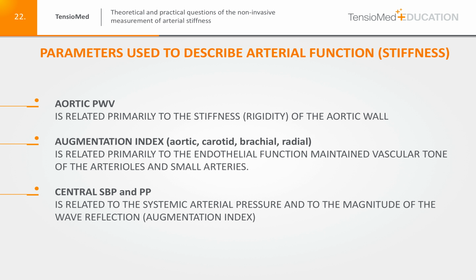And the central systolic blood pressure and central pulse pressure. This parameter is a bit of a mixture because it is related partly to the systemic arterial pressure and also to the magnitude of the second systolic wave reflection amplitude, basically to the augmentation index.